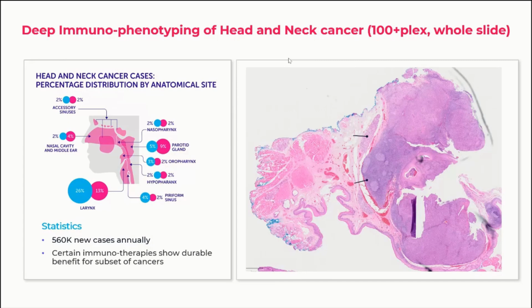Our working hypothesis was, okay, we've got this patient's tumor. We know the patient had a partial response to therapy. Could we identify regions within the tissue that might have been sensitive, might have been resistant? And so what you see on the right here is the H&E of this tissue. This is what a pathologist looks at pretty much all day, a dual color stain of the tissue.